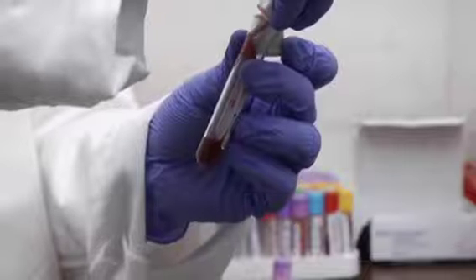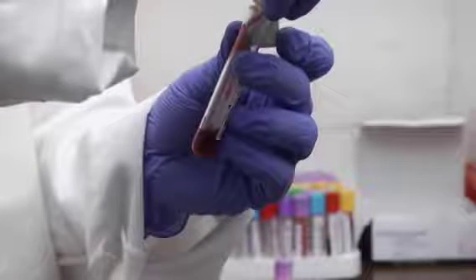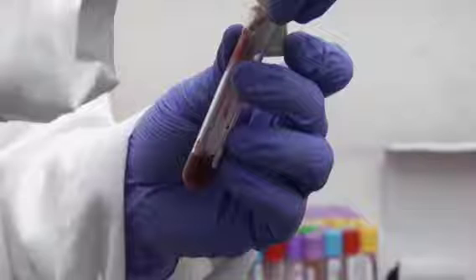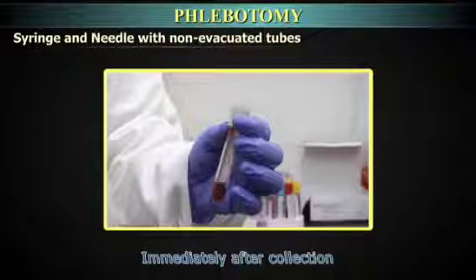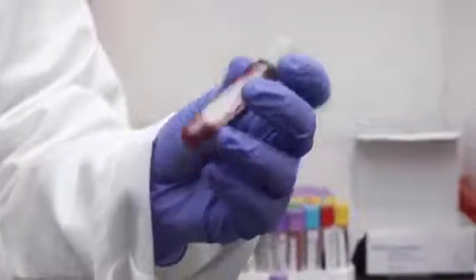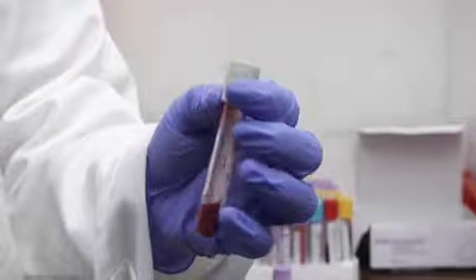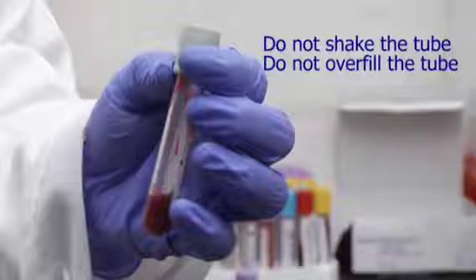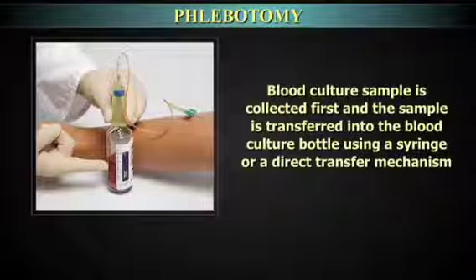Phlebotomists should never push the plunger too hard in order to avoid froth formation or hemolysis and the risk of aerosol formation. Immediately after collection, invert gently the tubes containing additives for the required number of times as specified by the manufacturer. Do not shake the tube. Do not overfill the tubes. Blood culture sample is to be collected first and the sample is transferred into the blood culture bottle using a syringe or a direct transfer mechanism as shown in the picture.